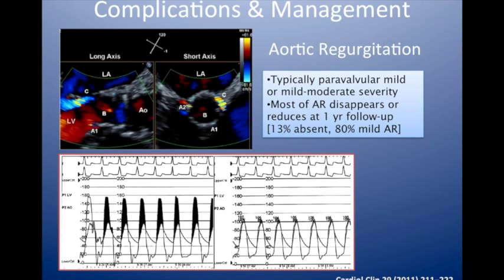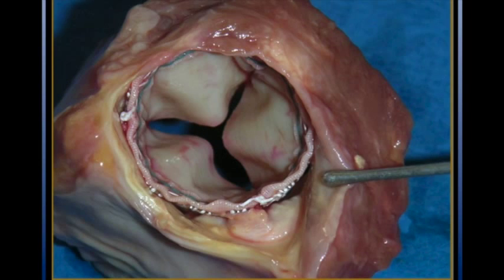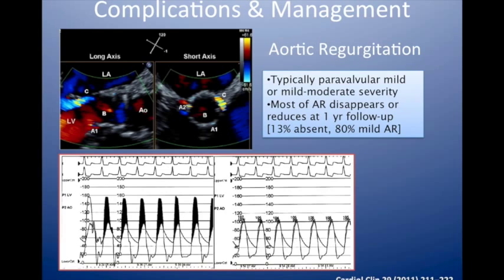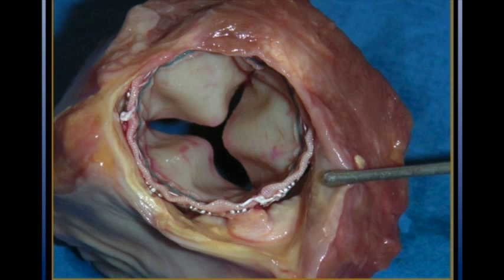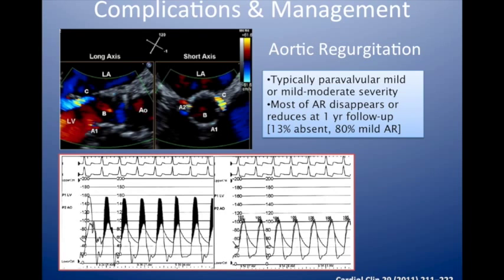This patient probably has moderate paravalvular aortic regurgitation — you can see it here, and there's another jet at 9 o'clock. The gradient has disappeared, so systolic function is great. But the separation of the diastolic pressure and the LV end-diastolic pressure is down to 20 mm Hg; the magic number is 25. If it's less than 25, we know there is hemodynamically significant aortic regurgitation. We then need echo to tell us whether it's paravalvular or valvular and exactly how severe it is. This shows how it might occur — you can see the valve is probably undersized, there's a gap, and there would be quite a moderate paravalvular leak.